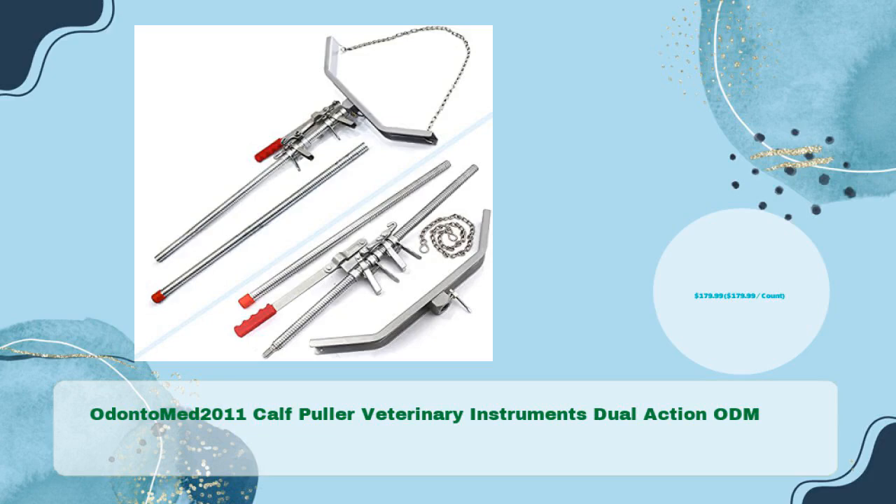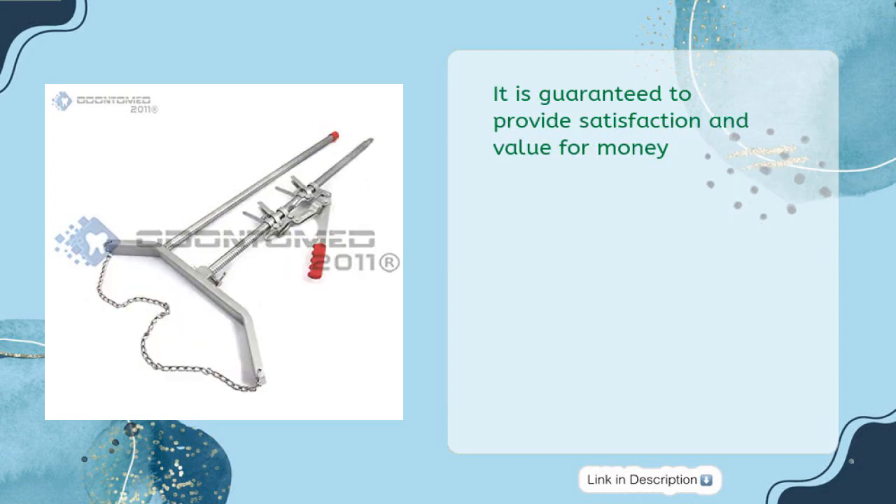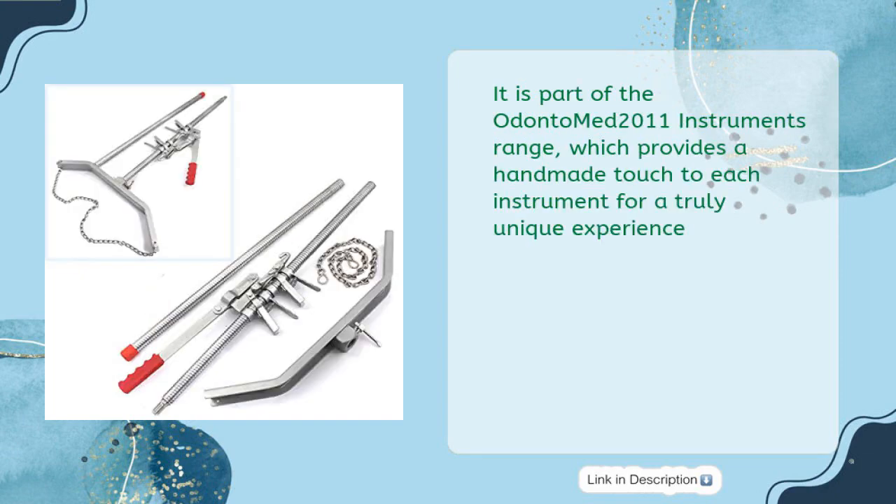Odonto Med 2011 Calf Puller Veterinary Instruments Dual Action ODM, available for just $179.99. Made from premium quality mechanical rod, nickel-plated, heavy-duty, and crafted from stainless steel for long-lasting performance. It is part of the Odonto Med 2011 Instruments range, which provides a handmade touch to each instrument for a truly unique experience.